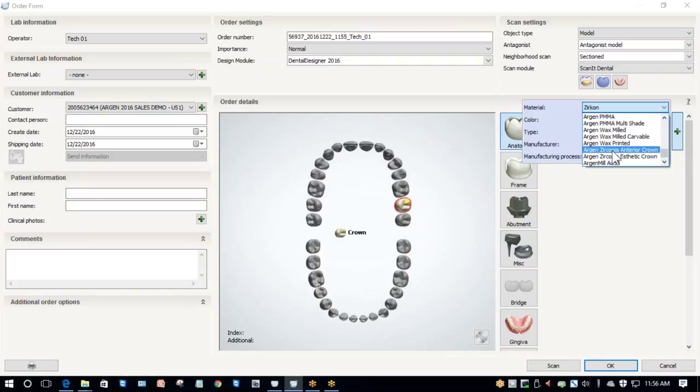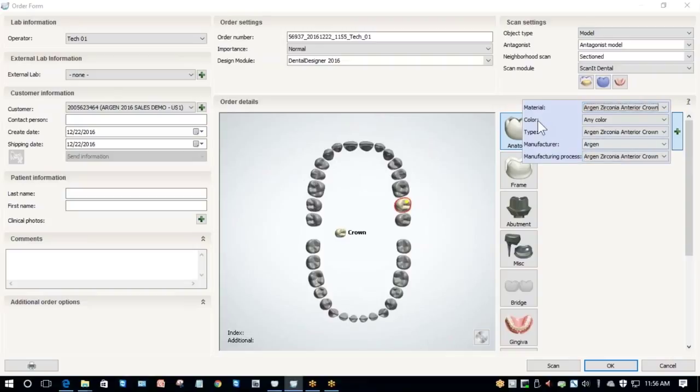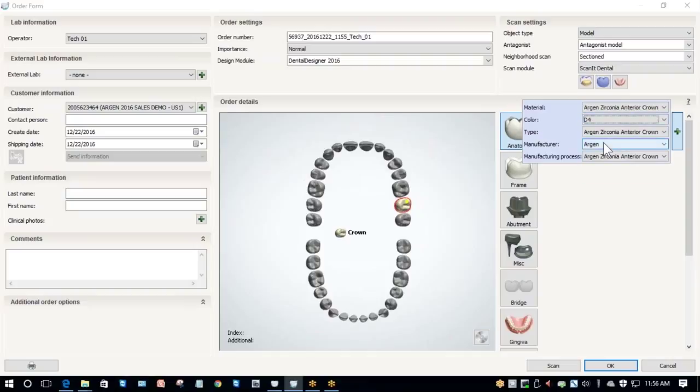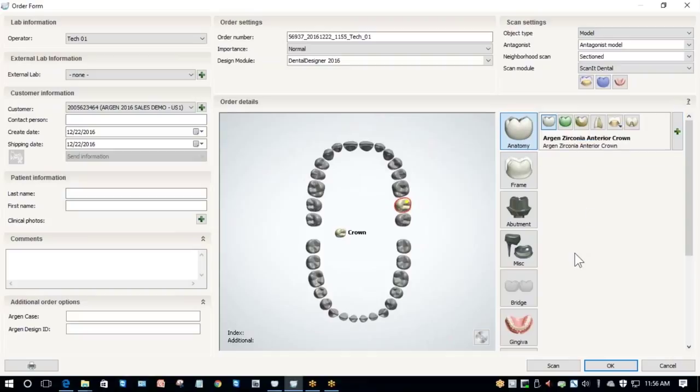Whenever I select something that is shaded, such as zirconia or PMMA, I need to also make sure I fill out what the shade is going to be. This patient has a D4 shade. Now that I've done that, I take my mouse off of this section and new information appears.